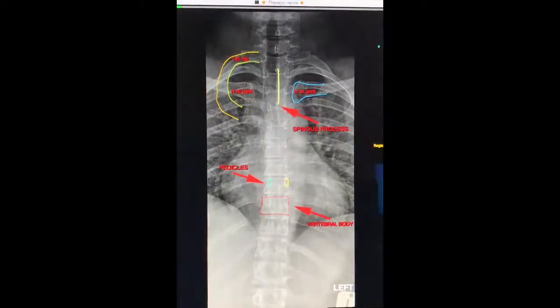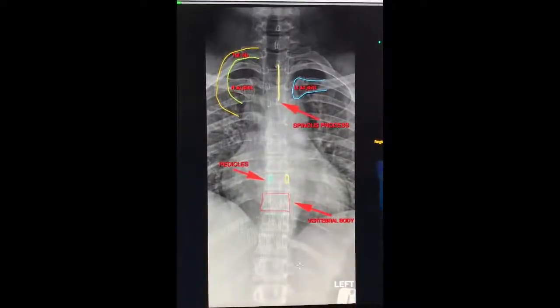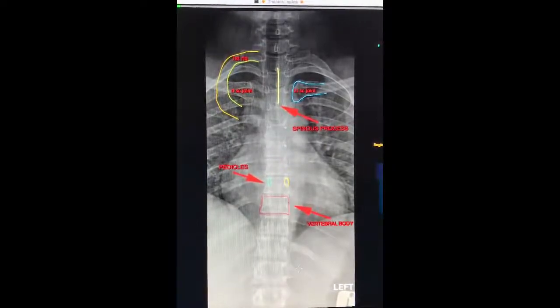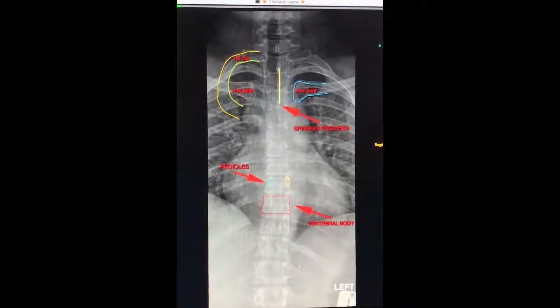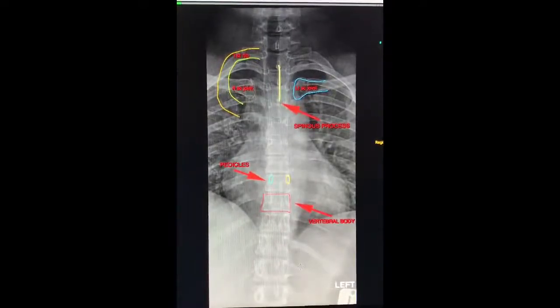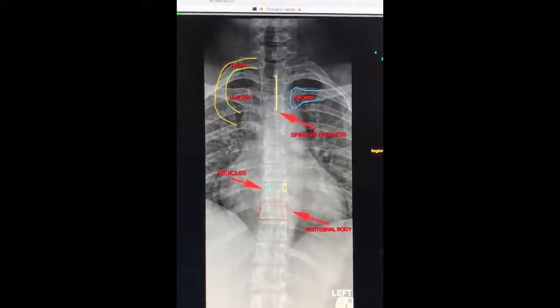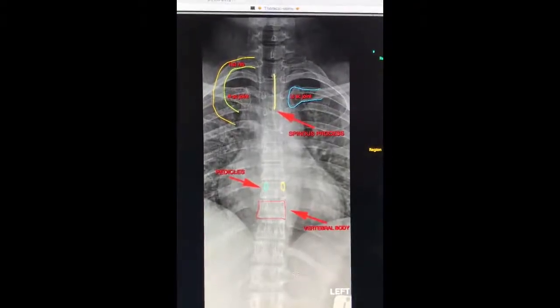Your medical legal requirements, you must have a lead marker. Your image must be nicely collimated. You should be able to have your patient identification, that's your patient's name, surname, your patient's identification number, the hospital identification number, the date and time of the examination. Also, somewhere on your image you should have the dose that was given to the patient or your exposure index. Also remember to check your x-ray for any artifacts, and yeah, that's about it when it comes to evaluation criteria.